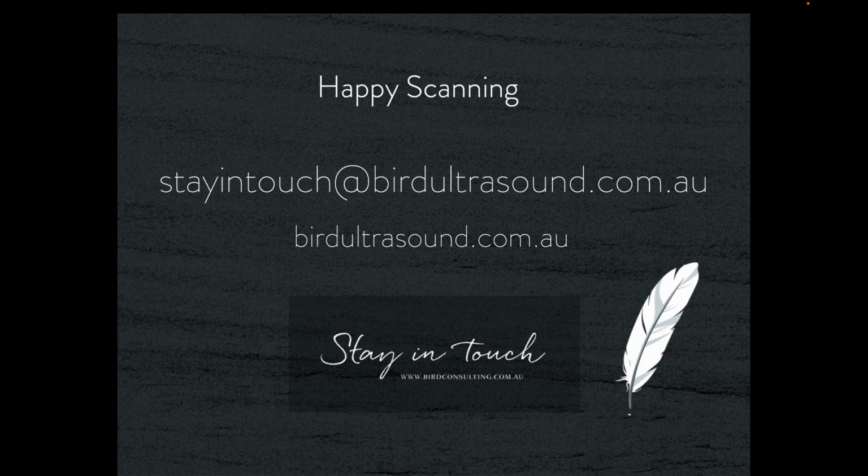Age match it for your patient. So clearly, if this gentleman was 80 years old, I wouldn't have been concerned, but at the age of 44, I think it's worth reporting, and adds another string to the bow of how we manage our patients in the vascular world of ultrasound.